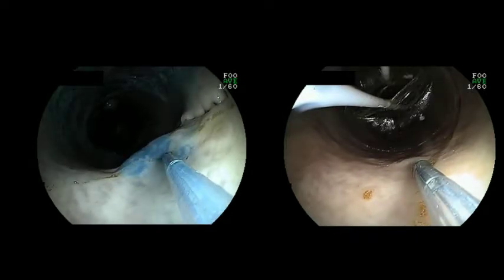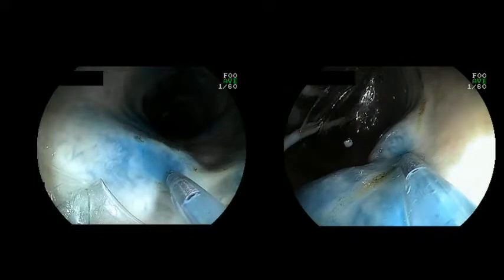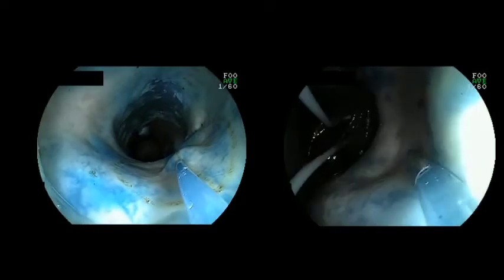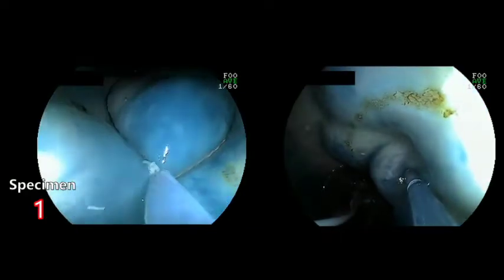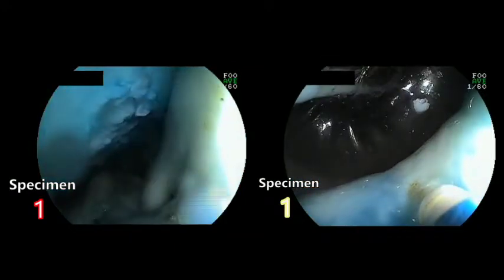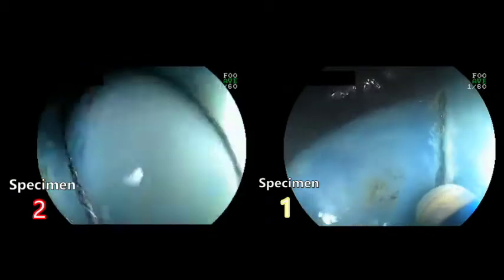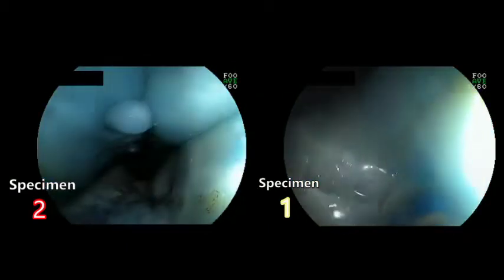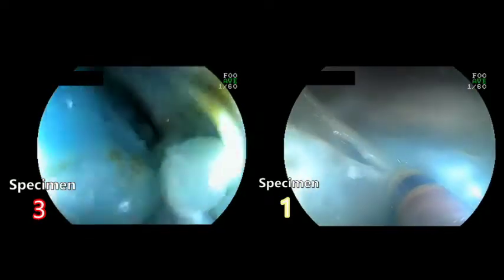by the biopsy forceps. Here we show you a side-by-side representation of the procedure, the left being conventional EMR and the right being the double balloon hybrid EMR. After injection of the lesion, in the conventional method, repeated snaring is performed in a piecemeal fashion until the entire lesion is removed. We have added specimen counters in order to keep track of the specimens removed.